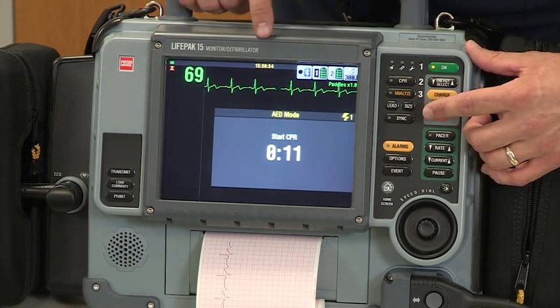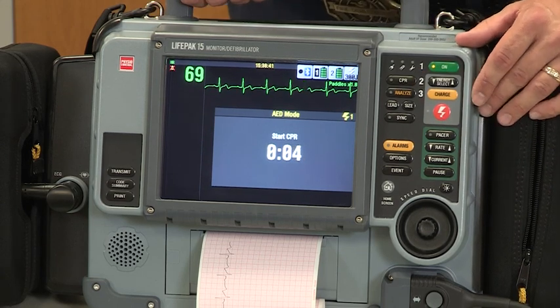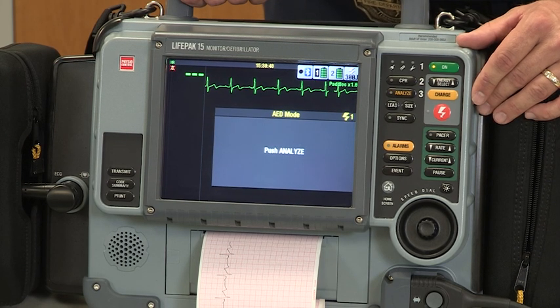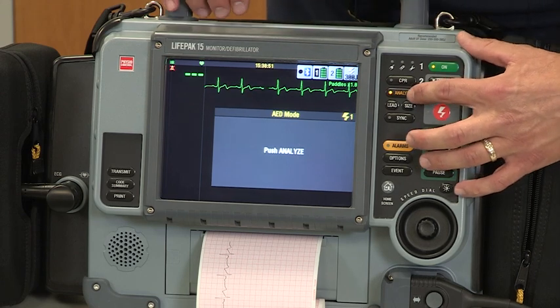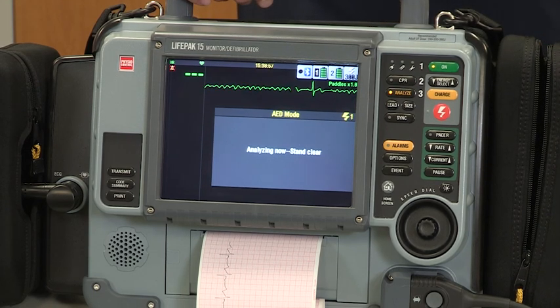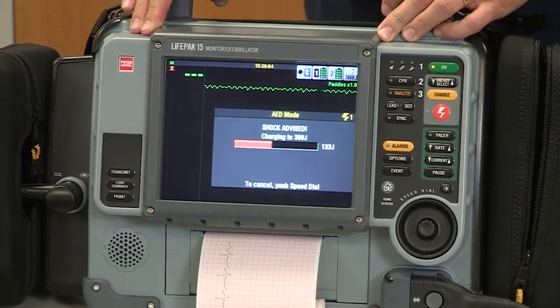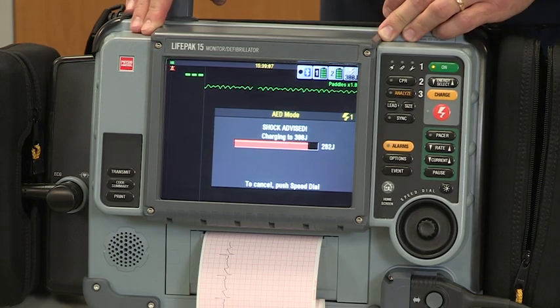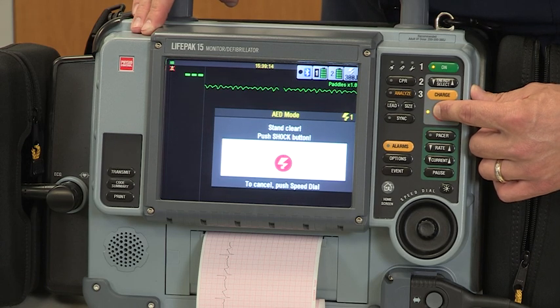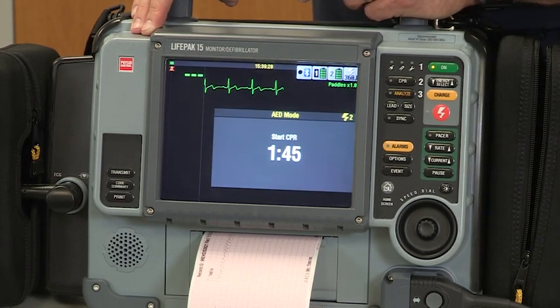Okay, now we're coming up to the end of our 2 minutes of CPR. We're still going to get a voice prompt with the A.E.D, even with the metronome off. We're going to demonstrate that right here. Push analyze. Again, we have to not touch the patient. Analyzing now. Stand clear. Shock advised. So again, a shock's been advised, and you see it automatically begins charging. Stand clear. Push shock button. Go ahead and push the shock button. Start CPR.